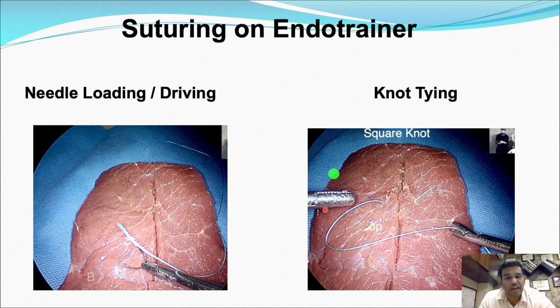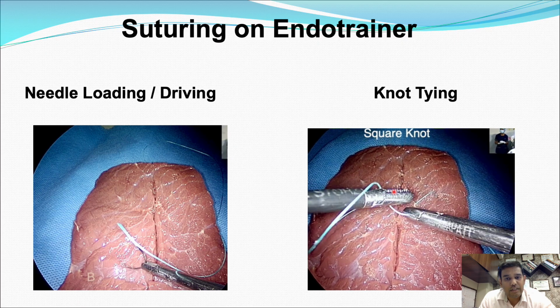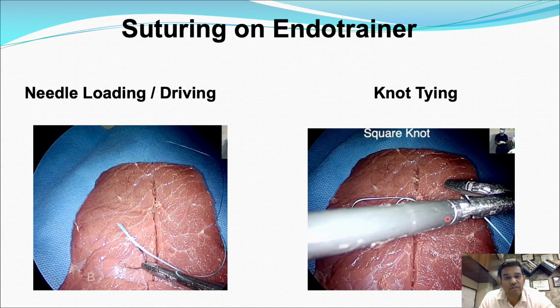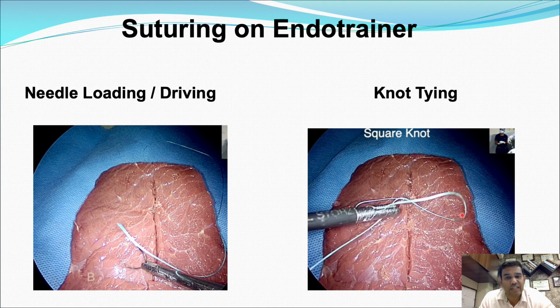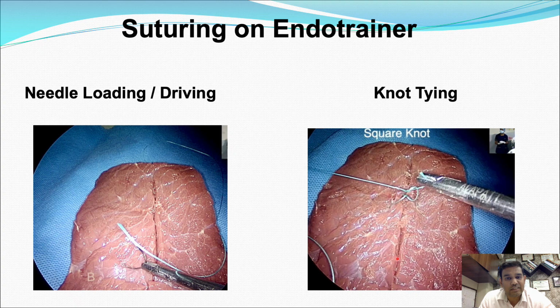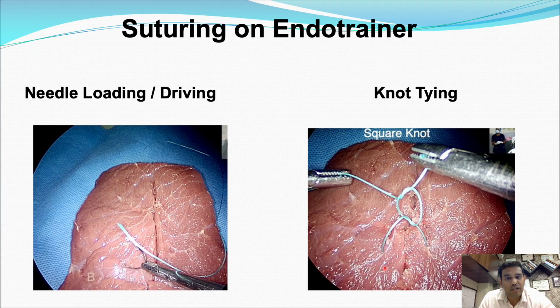Now the left hand goes above this loop in a tip to tip maneuver and takes two winds, and then you catch hold of the shorter end, and this will form a squaring of the knot. Again you bring the longer end towards the left side of the patient, and this will form a reverse C position of the suture, and then under wrap you go below this loop and catch the suture and you form a square knot. This is an example of a square knot. So this is the way you tie the suture.